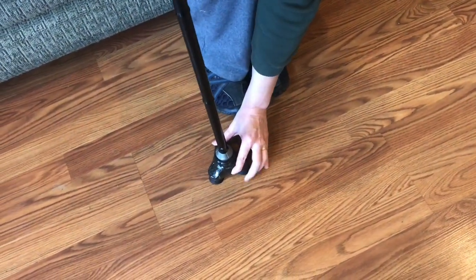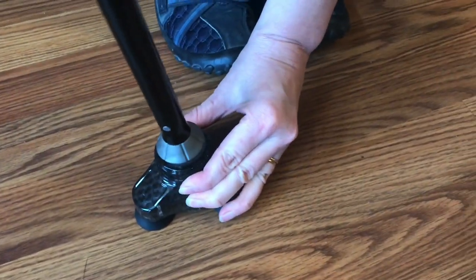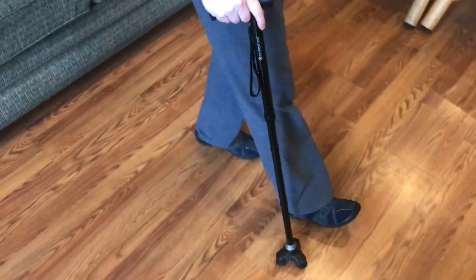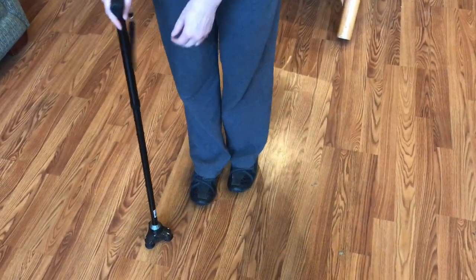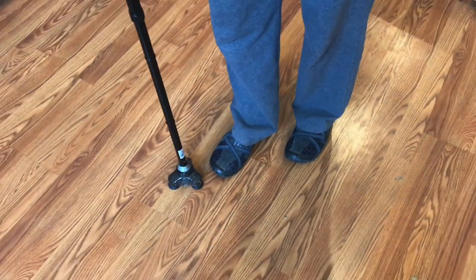There's a little bit of give in this. As you're walking it's going to have a little bit of a rock to it, which makes for easier walking because these three rubber grippers on the bottom are nice and flat on the floor while you are still taking your next step.